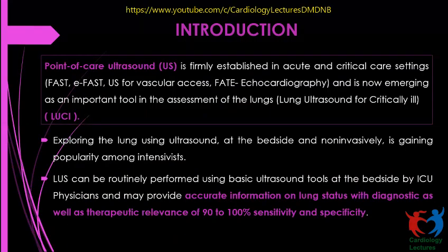So in introduction, point of care ultrasound is firmly established in acute and critical care settings. We have the FAST protocol, the extended FAST protocol, vascular access ultrasound, and focus assessed transthoracic echo in emergency to rule out cardiac conditions. And now what is emerging, becoming an important tool for assessment of the lungs, is lung ultrasound, also called lung ultrasound for the critically ill, LUCI for short.